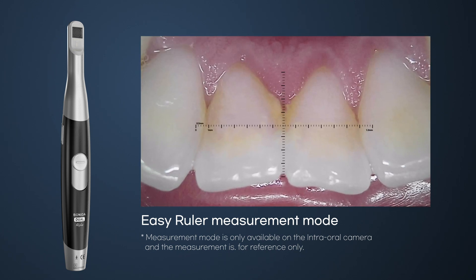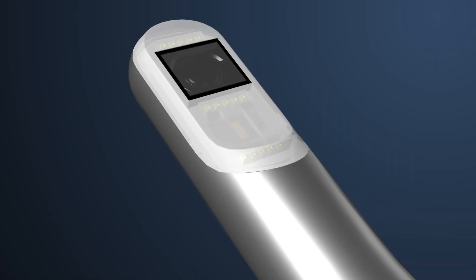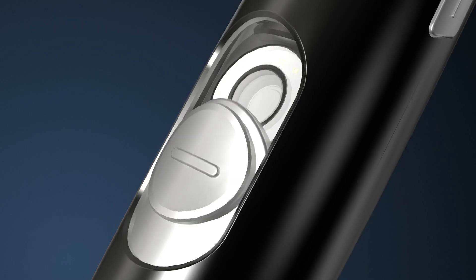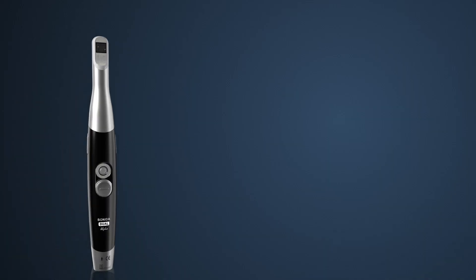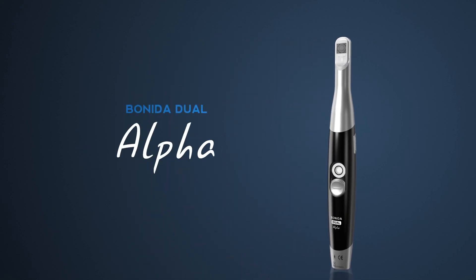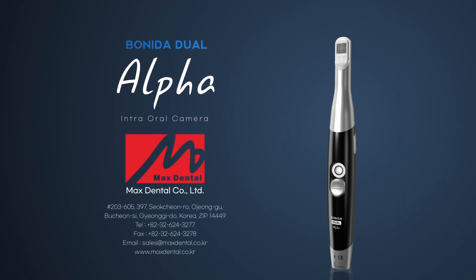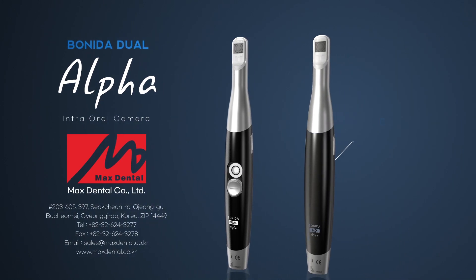The Bonida Dual Alpha offers a ruler measurement mode. If you press and hold the capture button for three seconds, a cross-shaped ruler will appear on the screen, and the scale of the ruler will change according to the distance between the camera and your teeth. A sub-model, the Bonida HD Alpha intraoral camera, is also available.